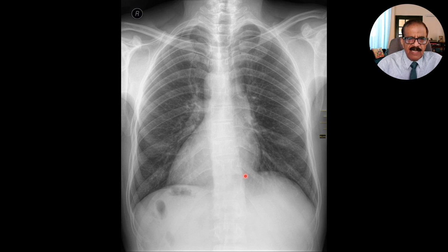So another thing is the cardiac location, whether the heart is present in its normal position or not. Now in this case, you can see this is labeled R, so this is the right side, and you see the heart on the right, this is actually a dextrocardia. You see it's a complete dextrocardia. Aorta is on the right, this is the aortic knuckle. You can see the descending aorta, aorta is on the right, the left ventricle, functionally the left ventricle, is also on the right, and you see the stomach bubble is also on the right.